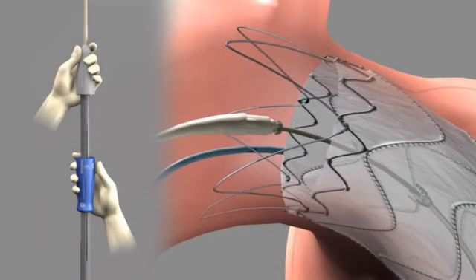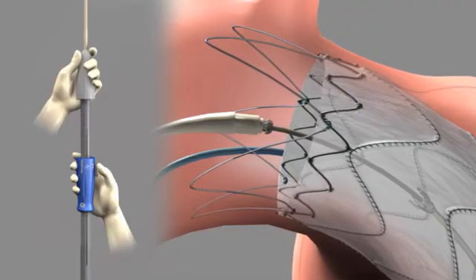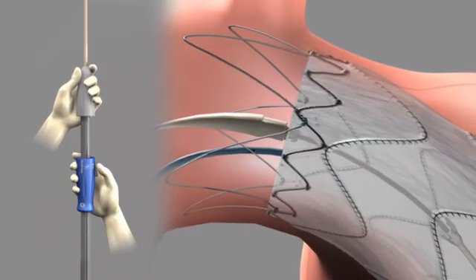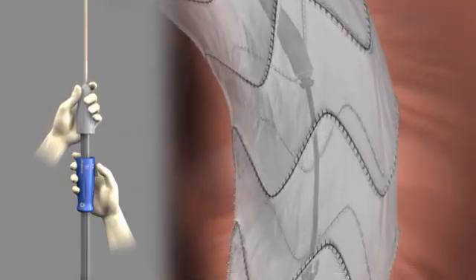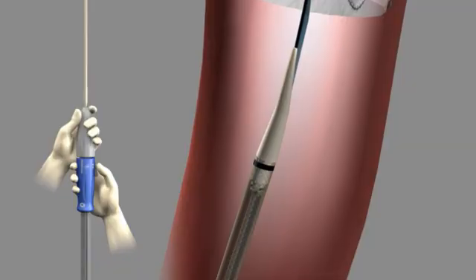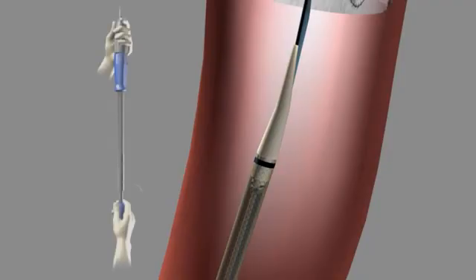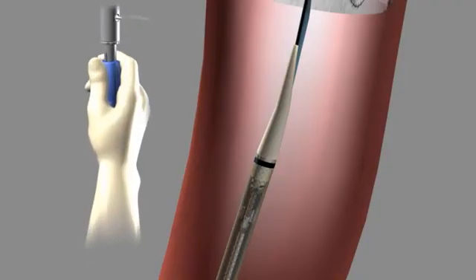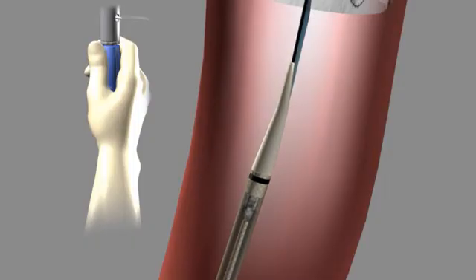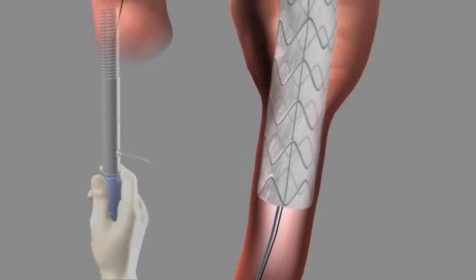To remove the delivery system, hold the slider stationary, pull the trigger, and bring the front grip toward the slider. Use continual fluoroscopy to visualize the stent graft and confirm that the taper tip has reengaged with the graft cover of the delivery system. After the front grip has been pulled back to rejoin the slider, push the tip capture release handle forward and remove the delivery system. Use fluoroscopy to ensure that the stent graft does not move during removal.